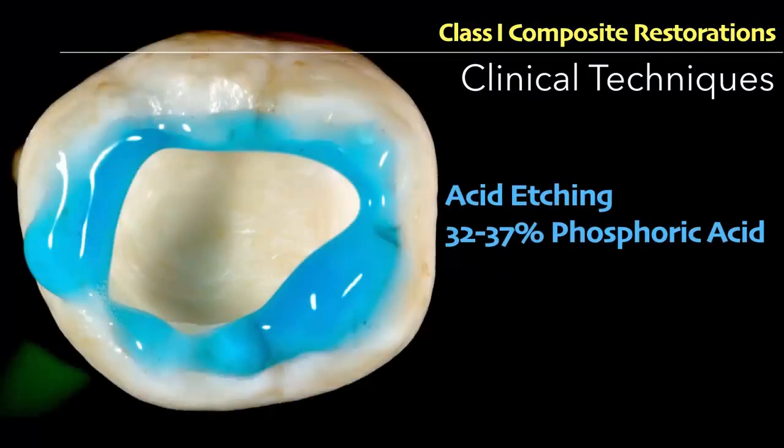Then we come to the etching. As you know, enamel is a different substrate and dentine is a different substrate, so we need separate systems for both of them. As enamel is more mineralized, has less water, and has no collagen, we use a total etch. It's the strongest acid, and we can wash and dry the enamel. There is no problem with that. But dentine has a lot of water and collagen, so we don't need to dry it. We need a system that can etch and bond it without washing and drying. For that, self etch is the best option for dentine etching and bonding.